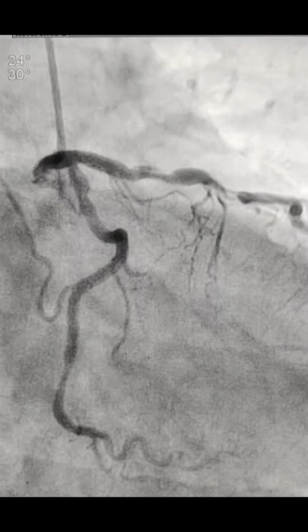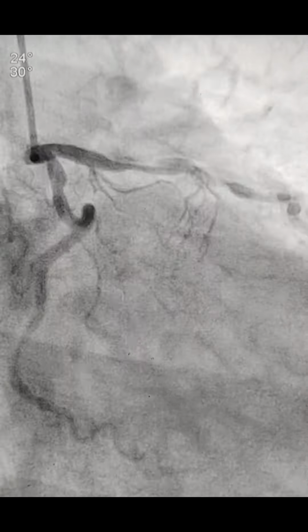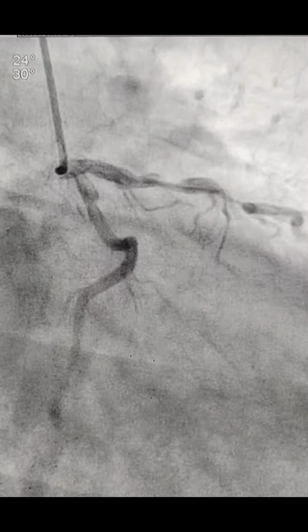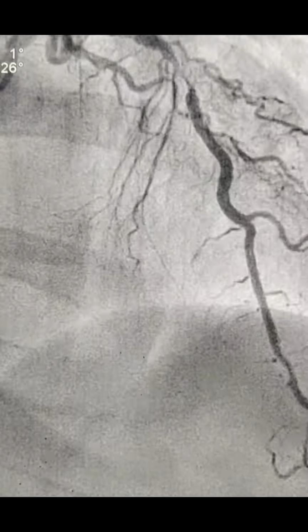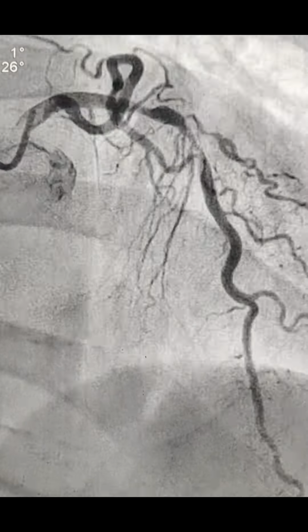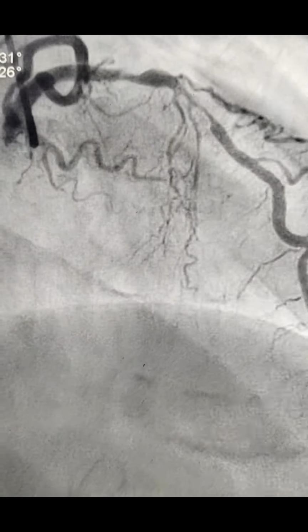And in this right caudal view, we can see clearly the LAD proximal to mid lesion, a bad lesion, almost 95% stenosis. And this is the cranial view, and you can see the same thing, right from proximal to mid LAD there is a tight lesion, almost 95%. And this is the right cranial view, and you can see the same thing here.